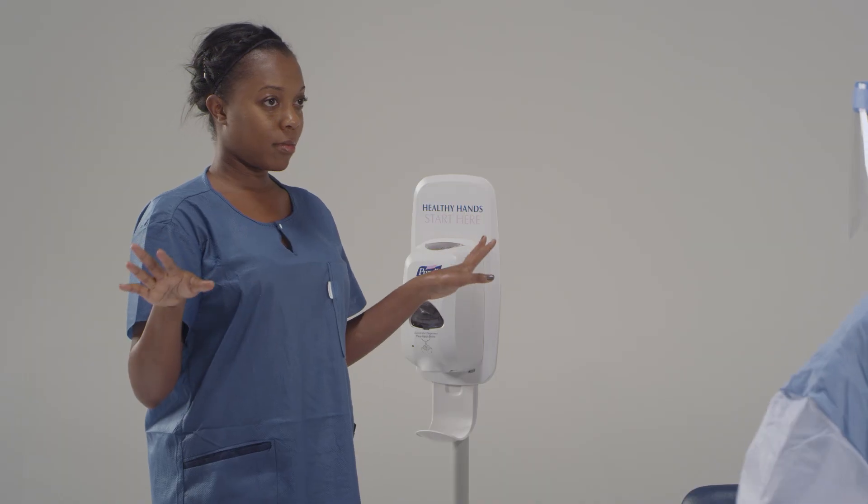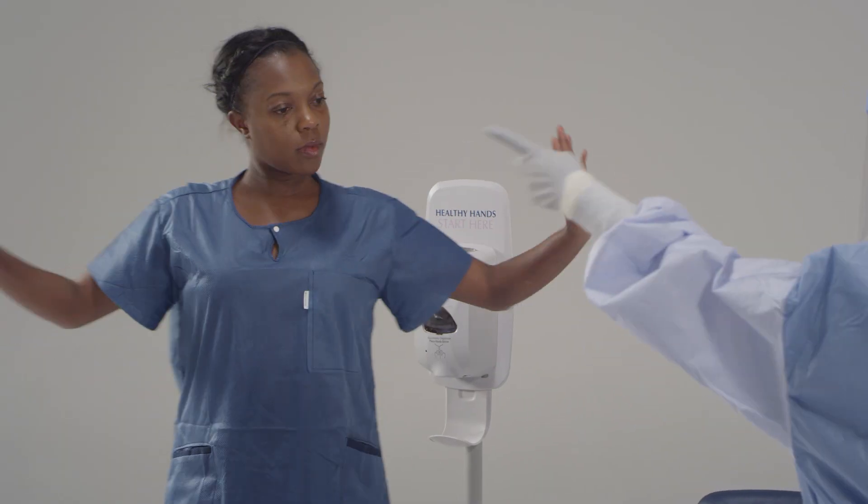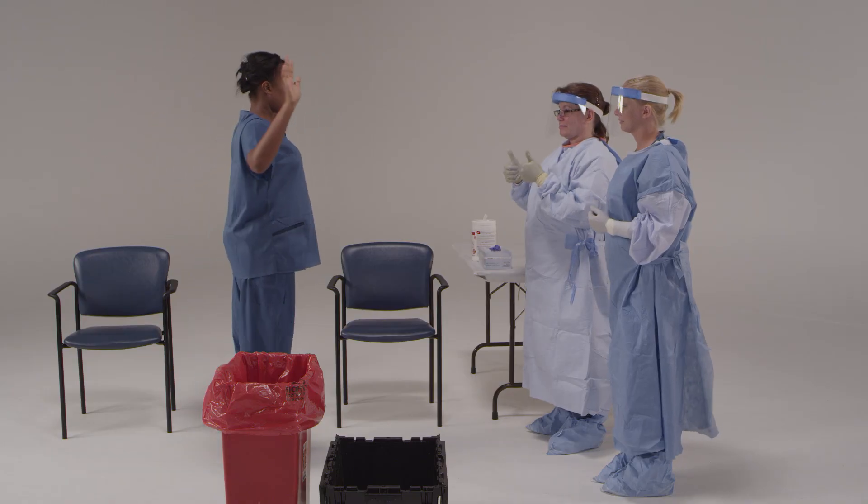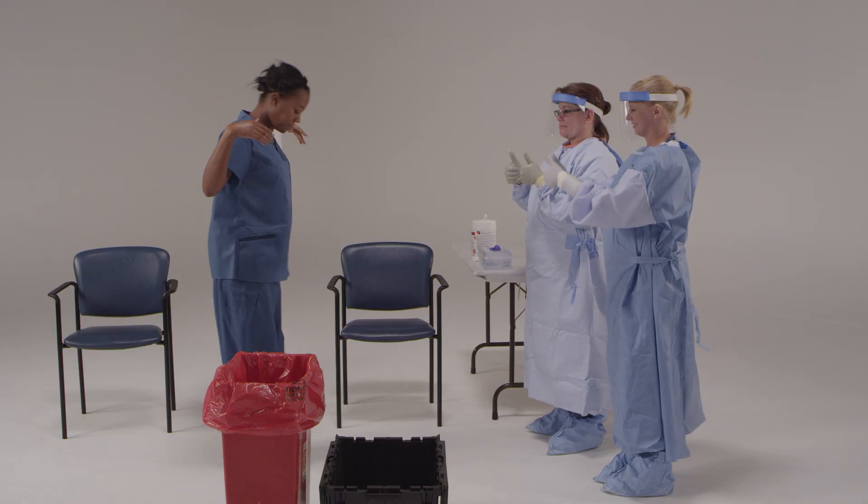One more important step: we need to check for any rips, tears, or contaminants on your clothes. Please hold your hands out to your side and slowly turn around. You, the assistant, and your trained observer will do one last inspection of your scrubs and inner clothing for holes, tears, or contamination.